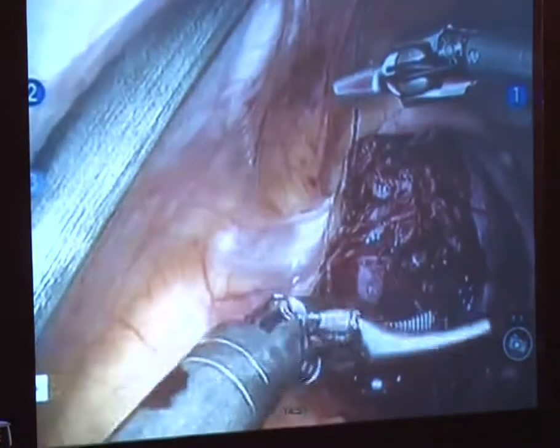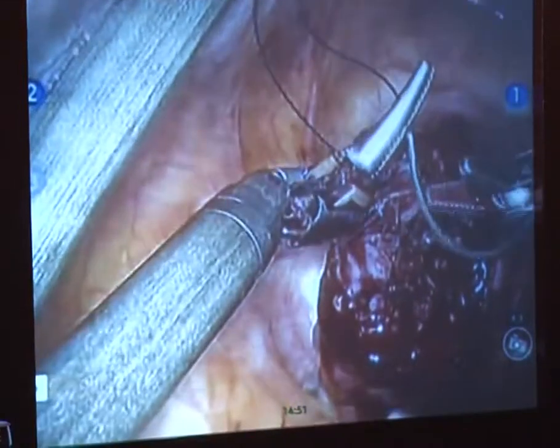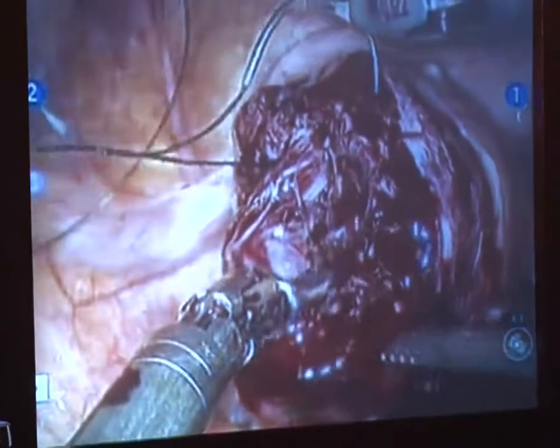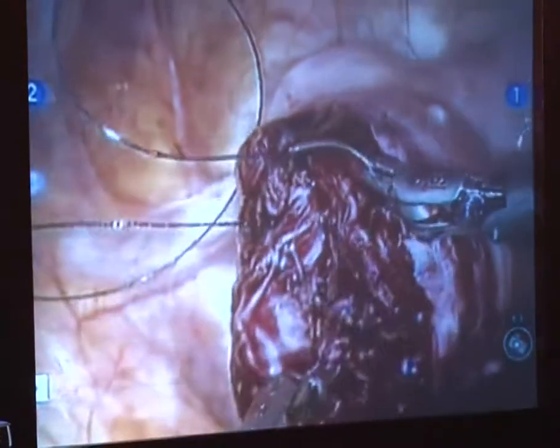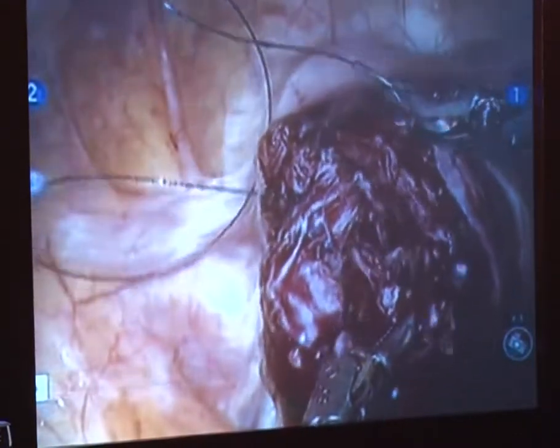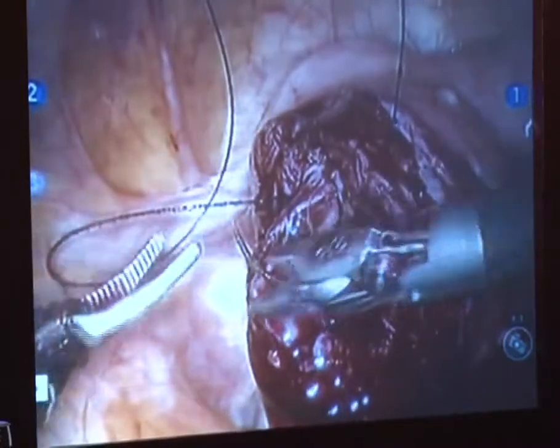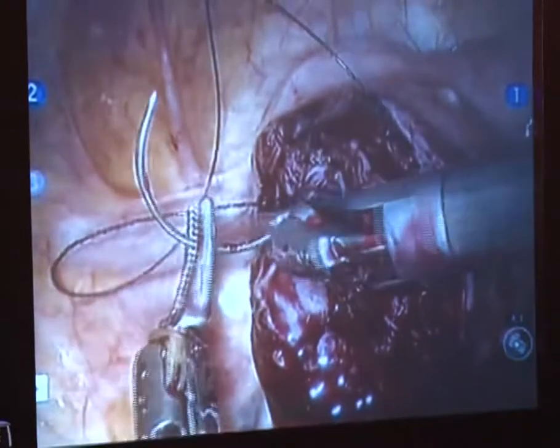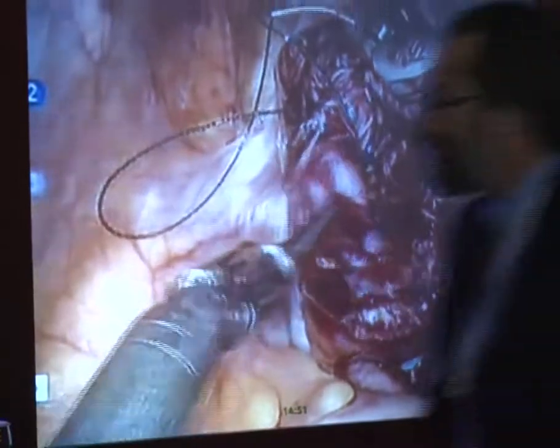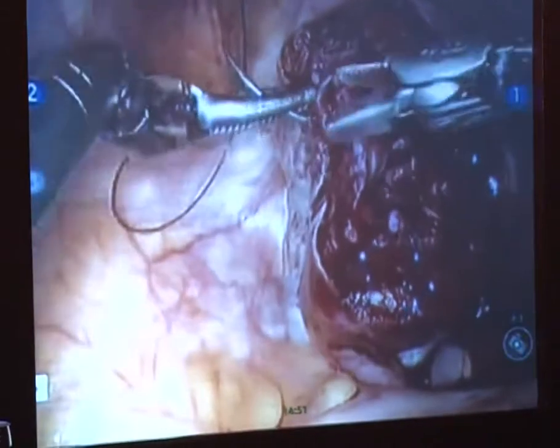I think in a myomectomy, I can't say whether it's necessarily, we talk about that with C-sections and classicals. It's hard to know, to be honest with you. I don't think it'll necessarily make her at any greater risk than the baseline risk for a rupture. I think a lot of our concern with rupture in myomectomy is probably too much use of electrosurgery, where you end up with a defect that's black. That's not going to come together.